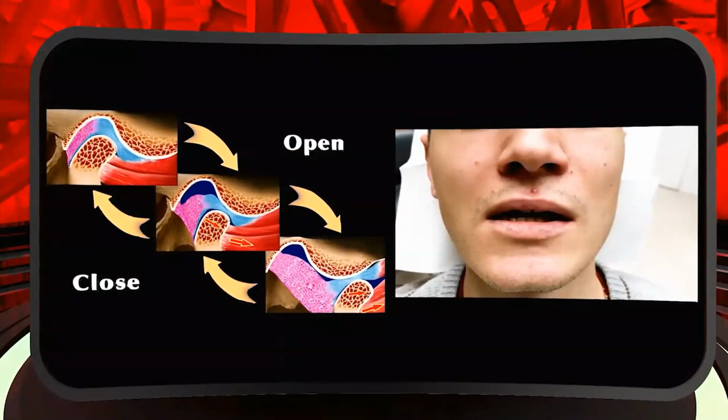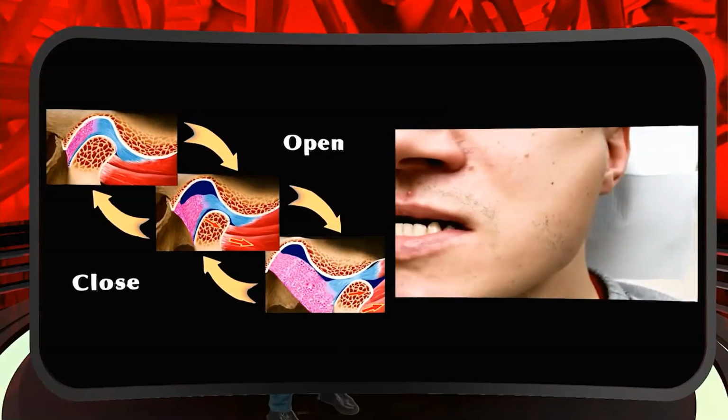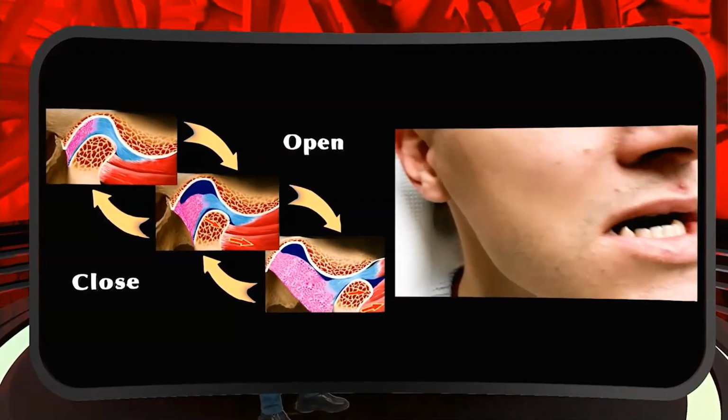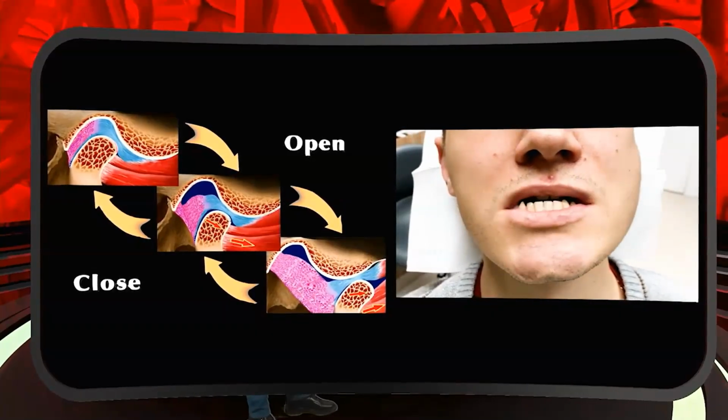So take a look at the left condyle. What's happening under the skin? You see that this condyle is going into excessive translation. The right one is fine. The left one is wrong. This is subluxation of this condyle.